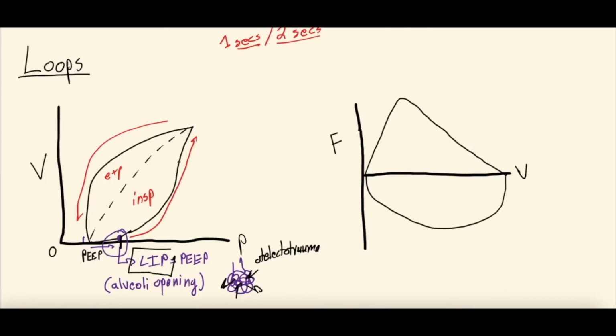The upper inflection point is where the curve of this waveform starts to change. We'll again make it more obvious. Excuse us, it's not going to connect, but that's okay. So the upper inflection point could look like this. It is where, again, the pressure starts to increase a lot and the volume does not increase. This is known as the upper inflection point, and this is when the alveoli start to get over distended, meaning they are too open.